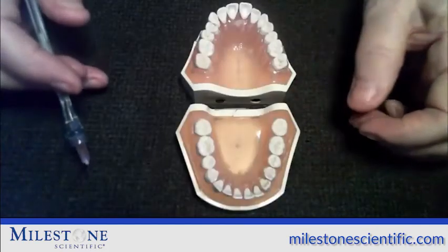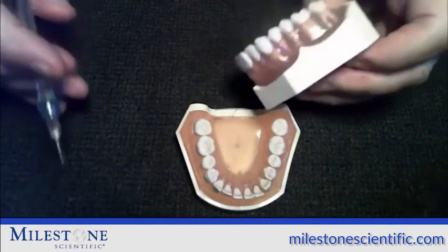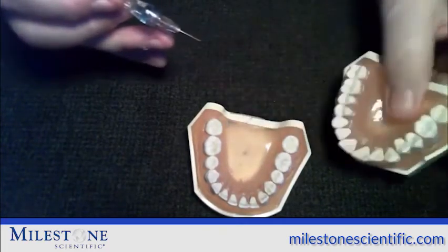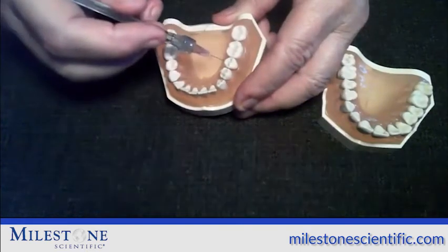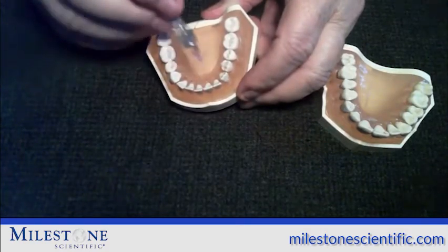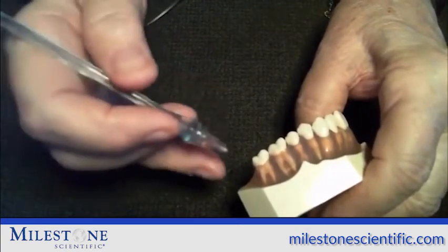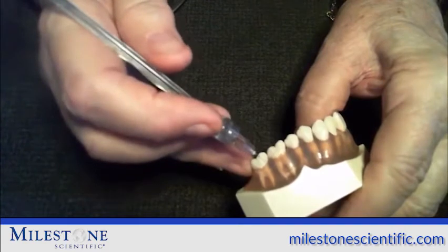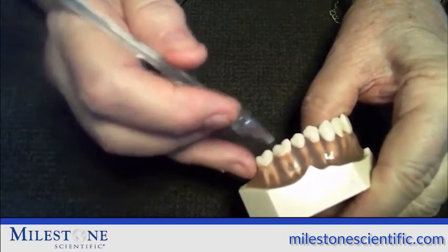The interligamentary injection is a very useful injection for anesthetizing any tooth or multiple teeth. Maxillary teeth have two injection sites: the distal buccal and then the mesial buccal. On the lower teeth, we go to the lingual, so the injection sites are the distal lingual and then the mesial lingual. On lower anterior teeth that have short roots, only one site is needed — usually the distal lingual of the four incisors. This injection is different from the traditional PDL injection in that we're not going to use force or pressure to force anesthetic down the PDL space to the apex for a short duration. Instead, we put the needle into the sulcus, move it down until we reach resistance, and let the anesthetic flow into the bone around the tooth.